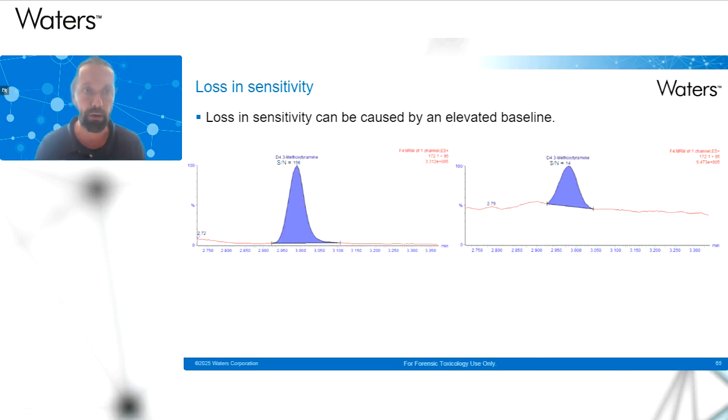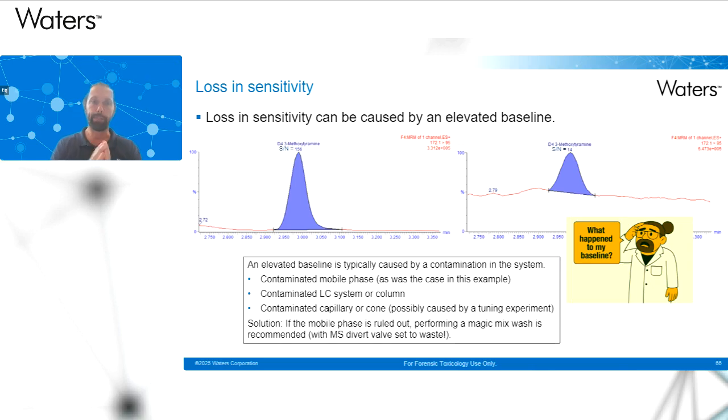In this case, we have an example of, on the right-hand side, an internal standard with a very much elevated baseline. And that for sure will result in a higher background, even though the peak height is larger on the right-hand side compared to the left-hand side. In terms of signal to noise, the sensitivity is down. So what happened to the baseline? Well, in many cases, when you observe an elevated baseline, this is related to some type of contamination present in your system, be it in the mobile phase, within the column, or in the LC system. In this specific case, there was a contamination introduced in the mobile phase by the pipetting tips used to transfer the formic acid into the aqueous bottle.